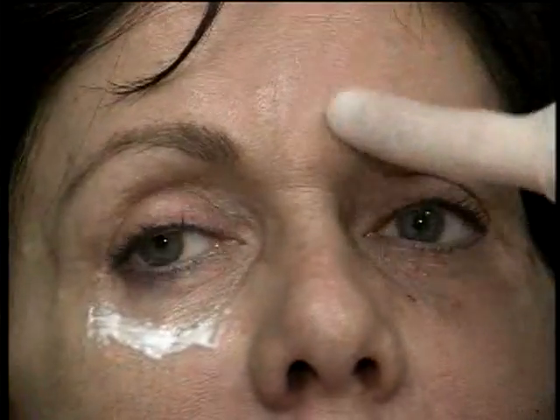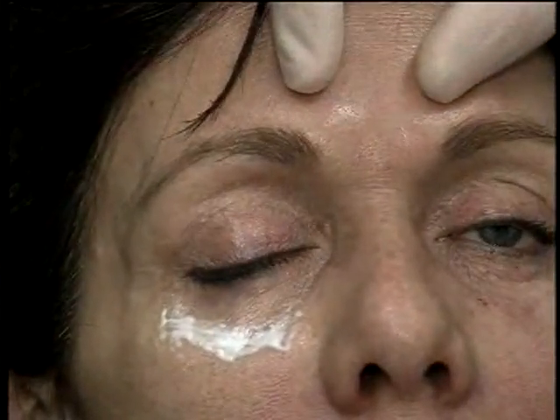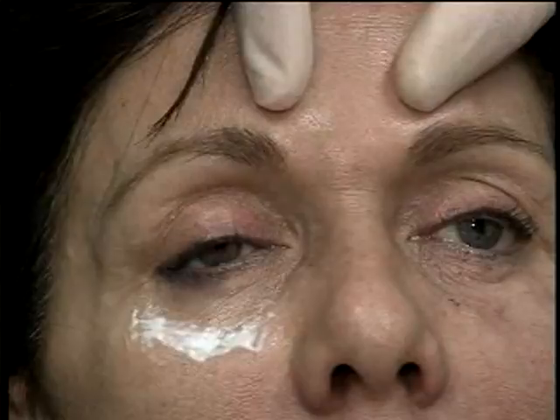I will also treat the glabellar area, which is right in here. If the glabellar creases are still evident, even though I spread them apart, then they're a good candidate. Most of her glabellar creases are eradicated by me spreading apart, so therefore she could benefit from Botox alone, but the combination may be helpful.